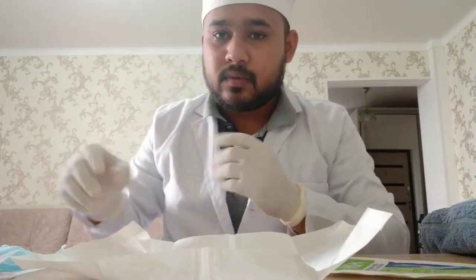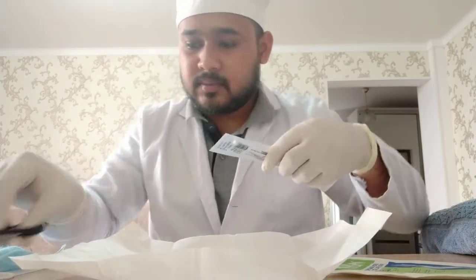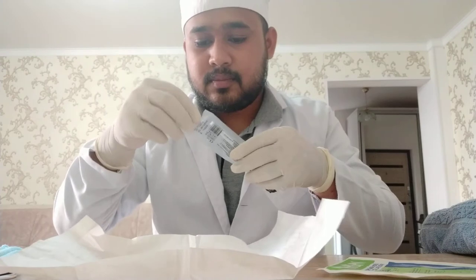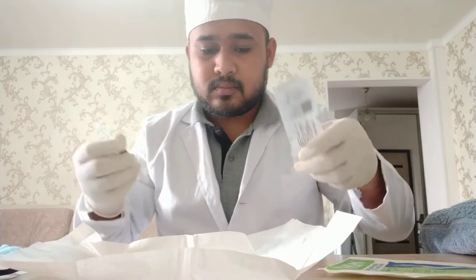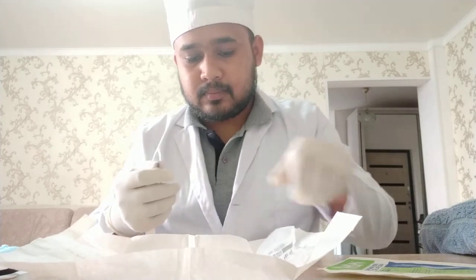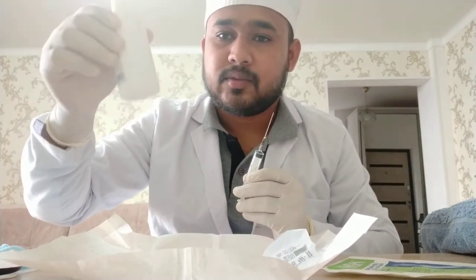Now I will prepare the IV. First of all, for the IV injection, I will cut it and I am using this as a container. And now I am using this as a medicine and I will take medicine from this.